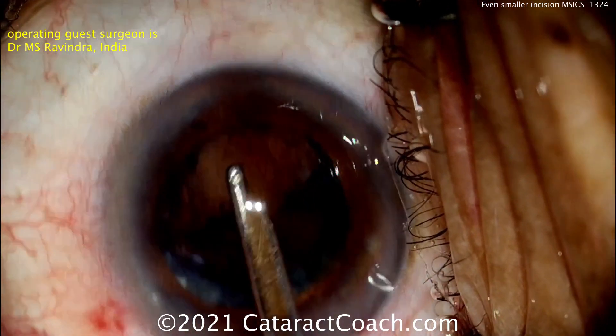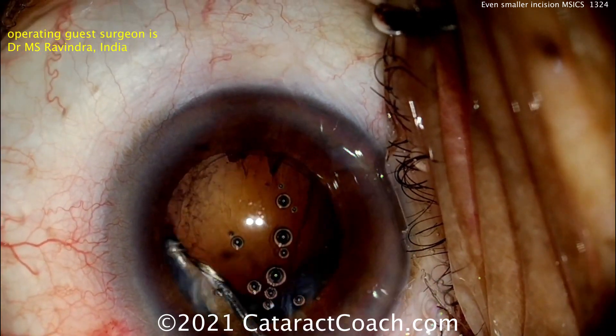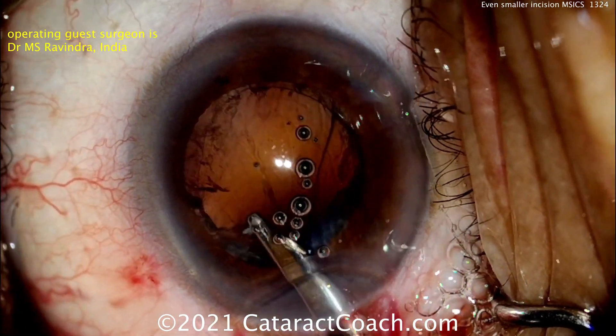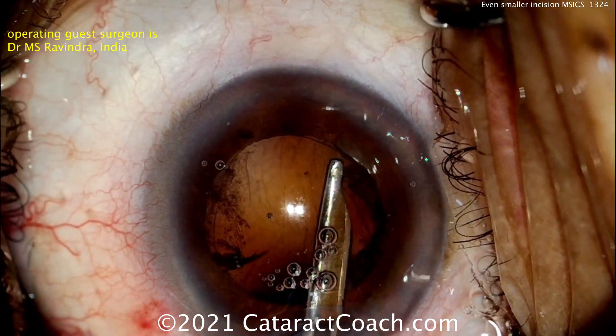Now wash out the remainder of that lens material — just using a Simcoe cannula to clean up, washing out the remaining lens cortex and aspirating that from the capsular bag. Looks pretty clean.